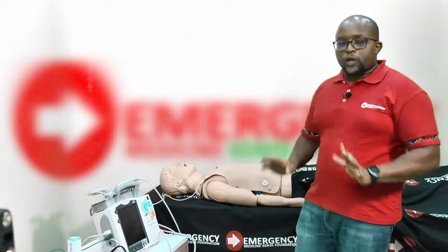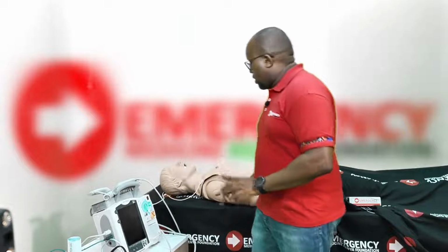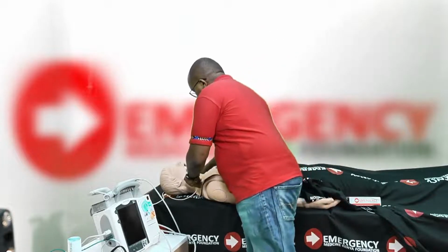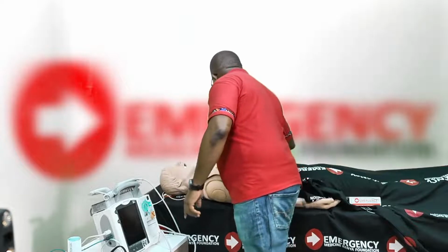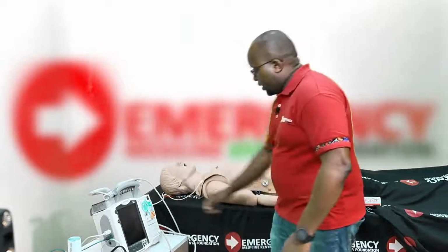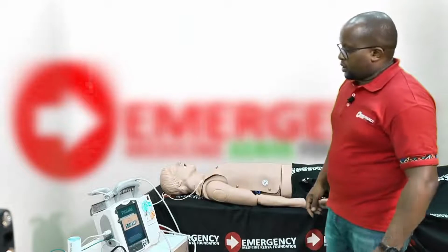Now, let me quickly demonstrate on my monitor what rhythms you're looking for. For this demonstration, let me connect the patient with the leads so that I can show you what you're looking for on the monitor. So I'll switch this one on.